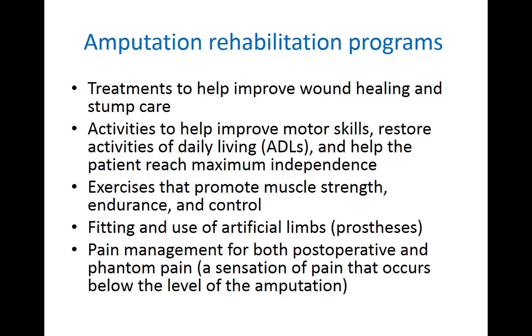I think many of you have seen crepe bandage application in cases of sprain or mild ligament tear. Those are crepe bandage applications in different cases of trauma. But when we talk about stump care, I think you've heard about figure of 8 bandaging. The normal anatomical shape of the limb is always cylindrical, so we try to bring the stump into a cylindrical or conical shape.